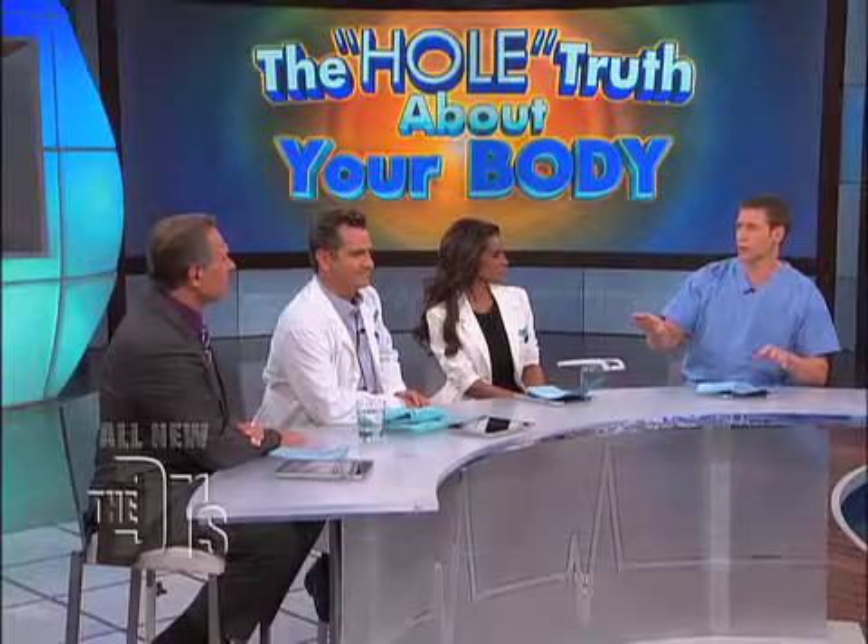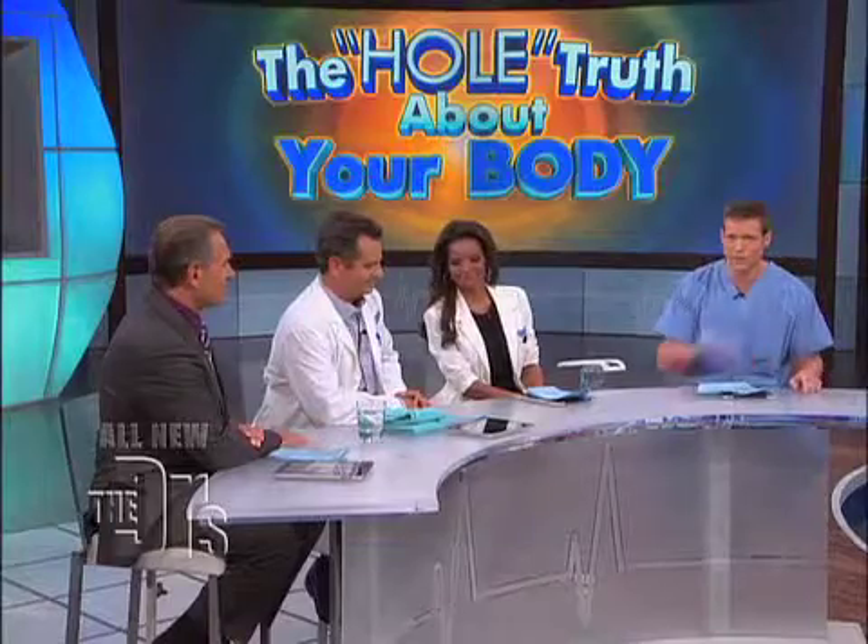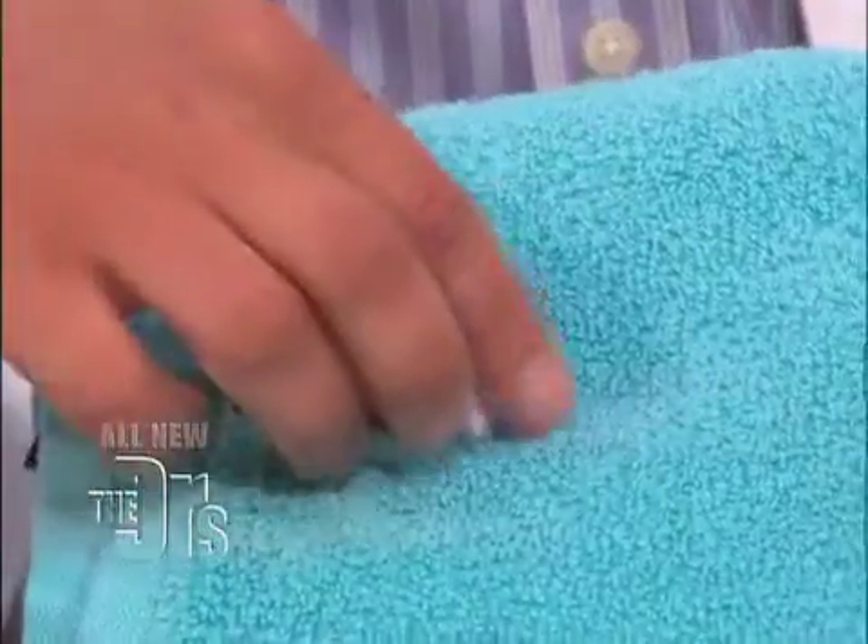Today we're going to show you this in a completely different way. We're going to take you inside the mouth in a way you've never seen, using the endo capsule by Olympus. Dr. Sears in real time is going to swallow this mini camera, and we're going to show everyone what the inside of your mouth and beyond looks like.